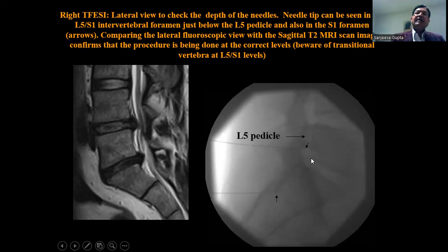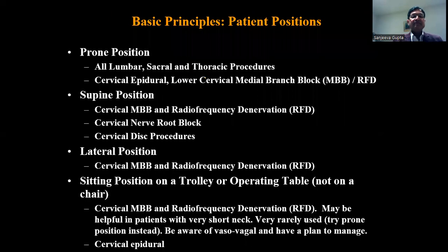So learning to read the MRI scan can be very useful, and in my opinion, it's not difficult at all. Just you need to put an effort, talk to your radiology colleagues, and they will explain to you. And once you start looking at this, it becomes more interesting. And when you show these pictures to your patients, they do get a lot of confidence in you, and that improves the outcome as well, in my opinion.